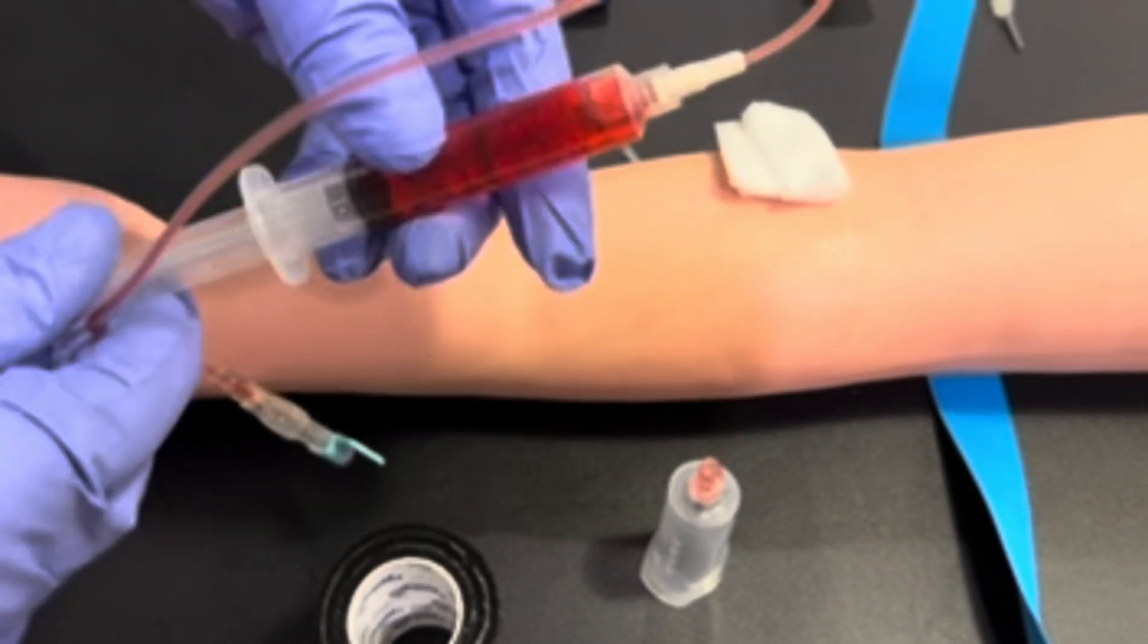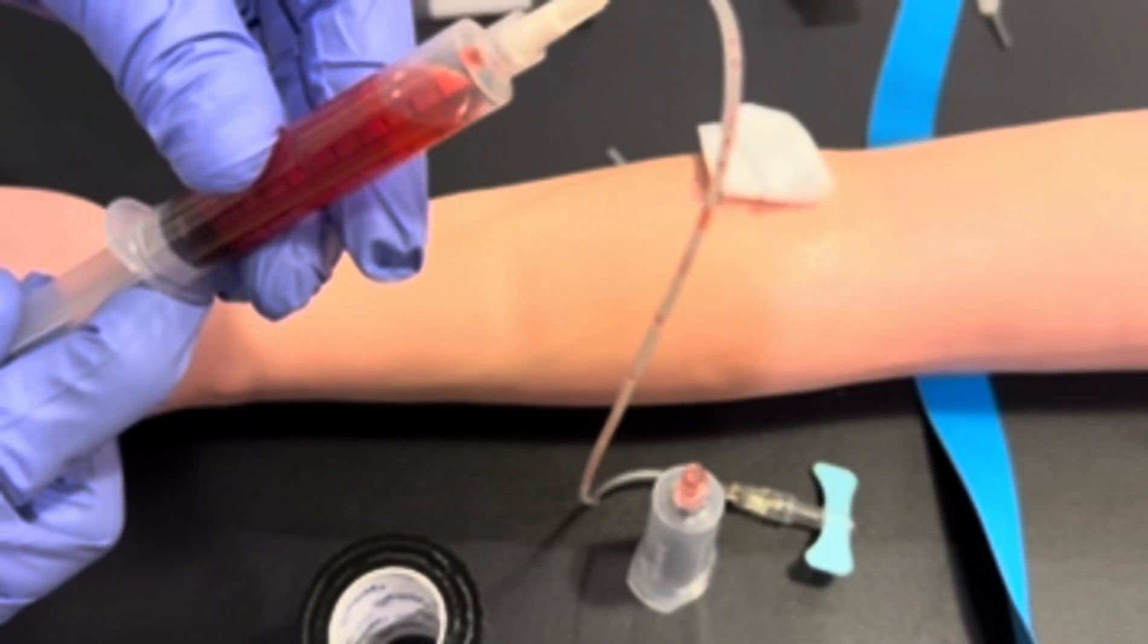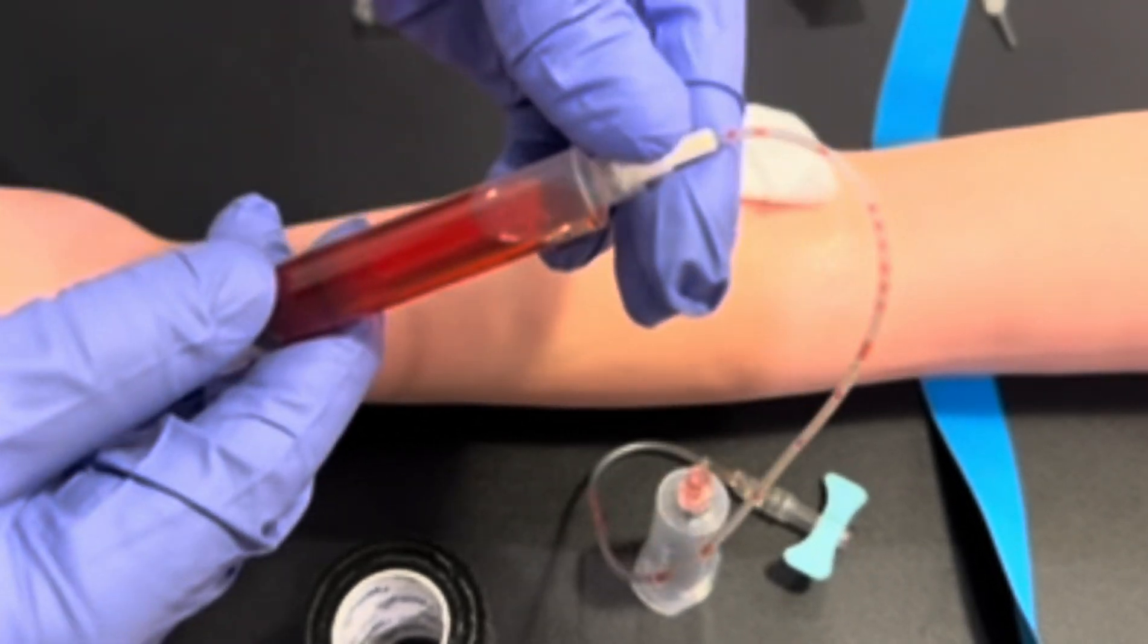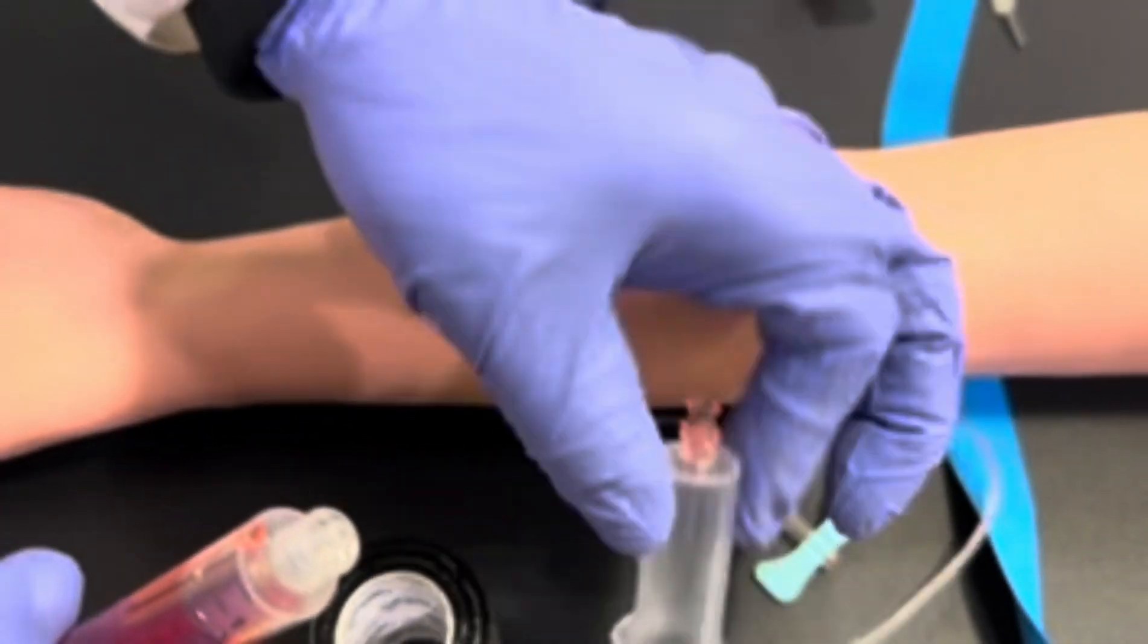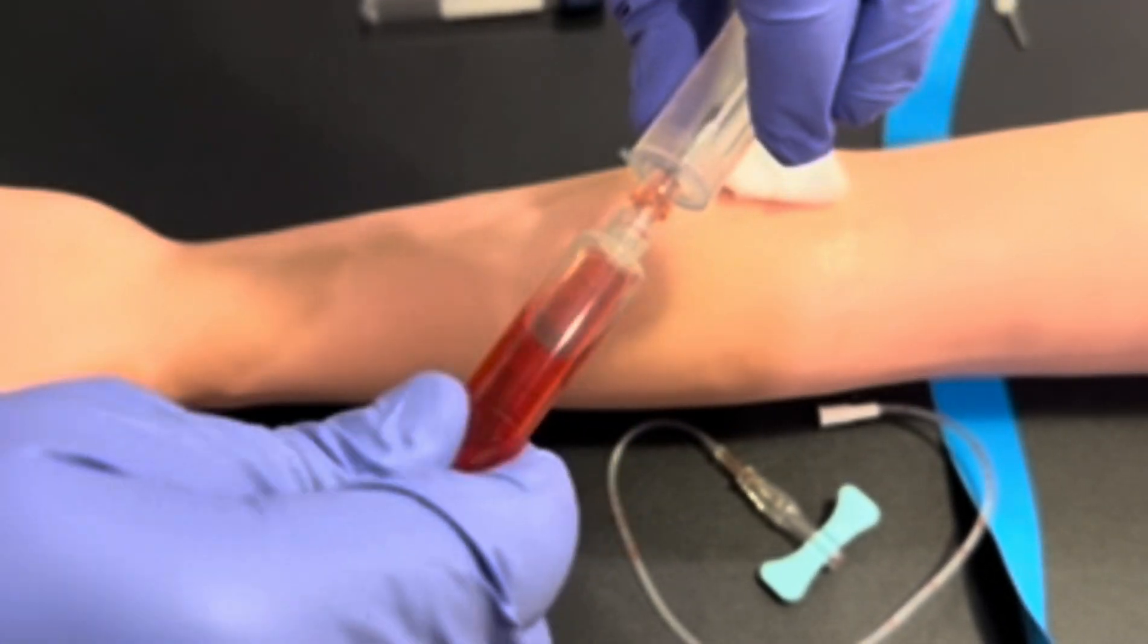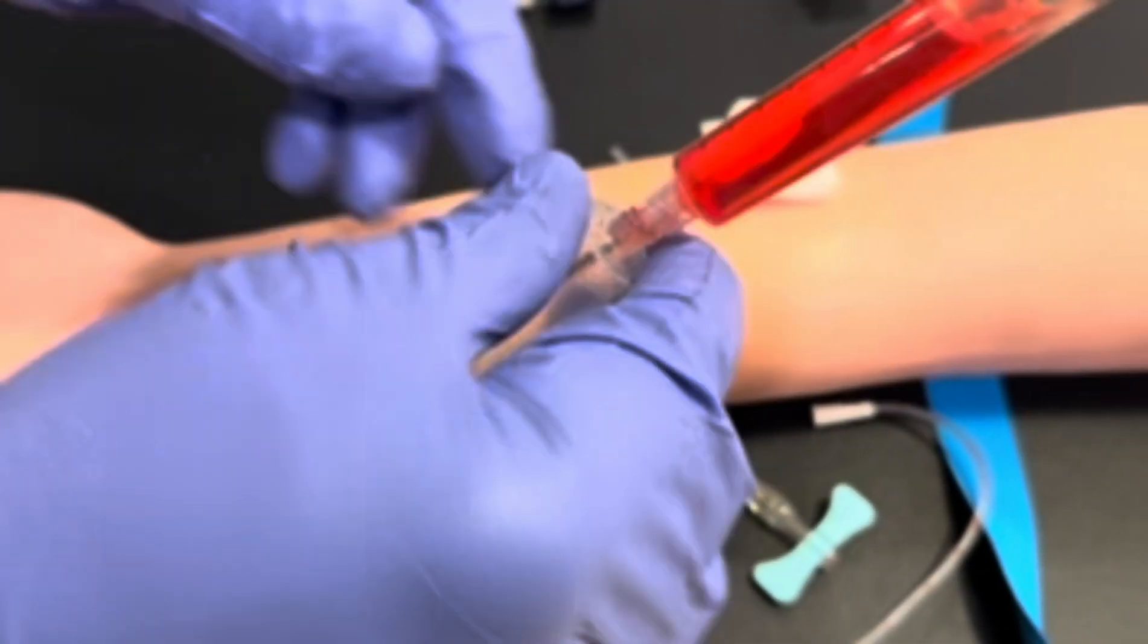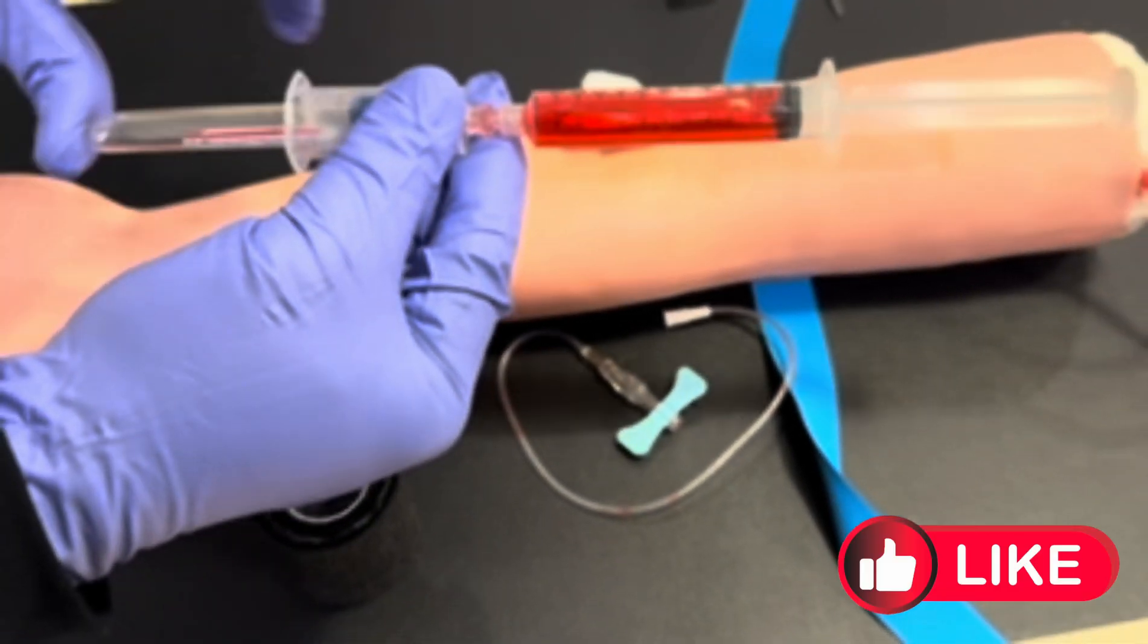Disconnect the butterfly from the syringe device and attach the syringe to the transfer device, so you can safely transfer your blood from the syringe into each respective vacutainer tube.